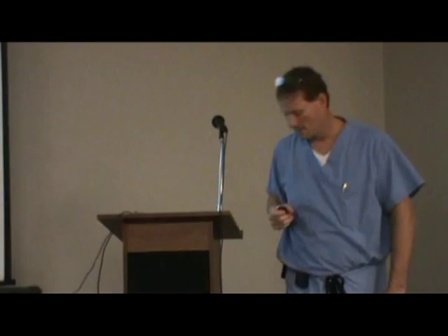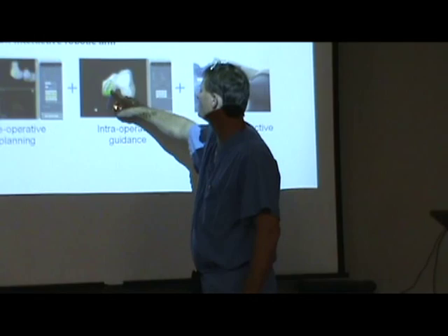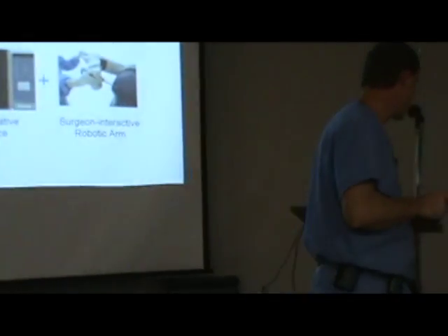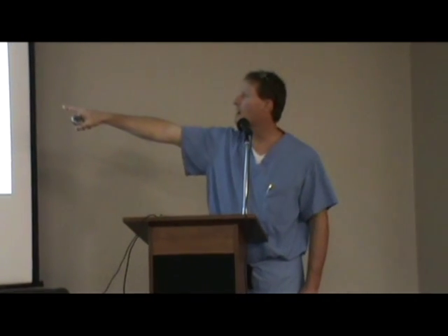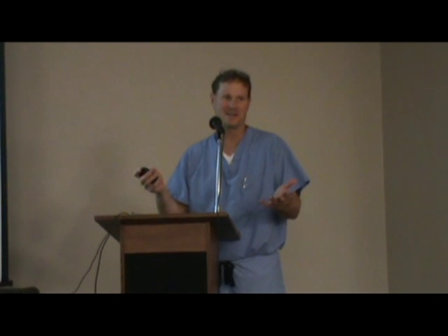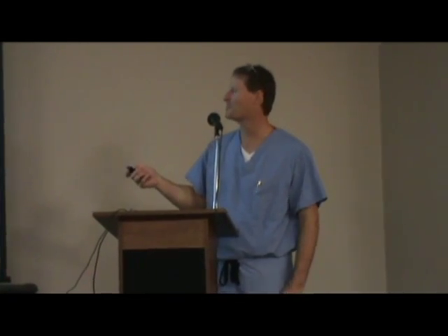It's extremely, extremely accurate. You can see the burr right here — that's the burr coming in, and this is the part of the bone that is to be removed to accept the implant. Very, very precise. The really neat thing about the robotic arm is that once you get to that point, it's almost foolproof. It's like coloring, but it won't let you get out of the lines. If you try to get out of the lines, it stops you and beeps at you. So it really is quite simple once you get to that point.